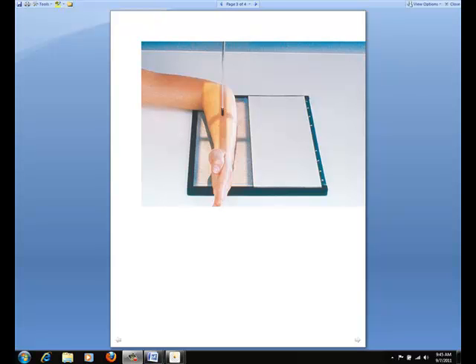For the lateral forearm, flex the elbow at 90 degrees to ensure that the entire joint of interest is included. Adjust the limb into a true lateral position. Make sure that the thumb side of the hand is up. The central ray will once again be perpendicular to the midpoint of the forearm, with collimation being 2 inches at the distal and proximal ends of the elbow joint, also 1 inch on each side.